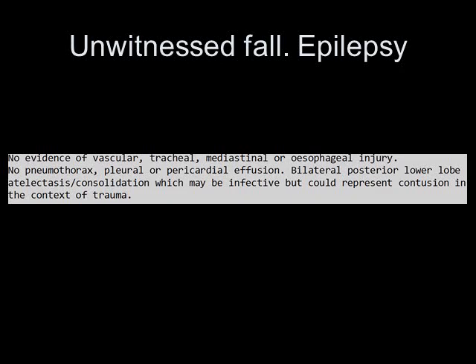I don't think that's a very helpful report. I would say this patient clearly had bibasal atelectasis. We don't need to get into consolidation or say they have infection unless there's some particular clinical supportive evidence.